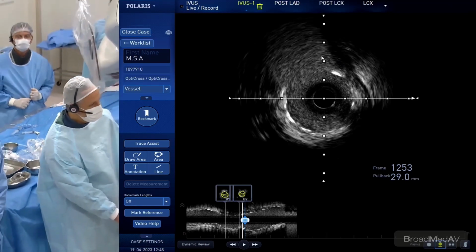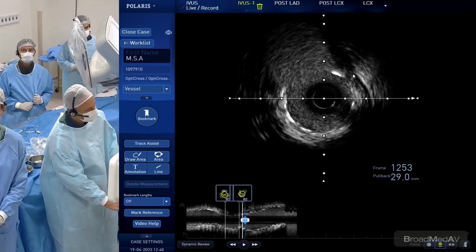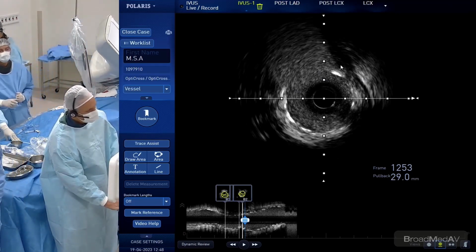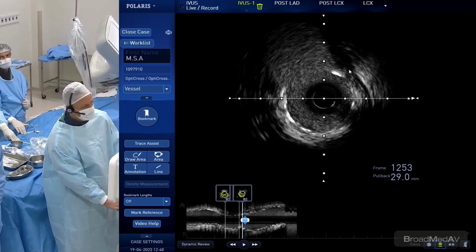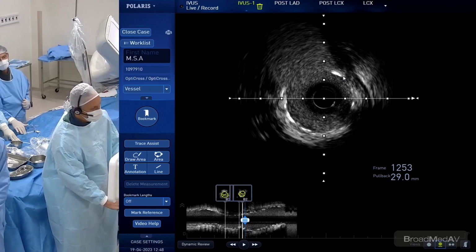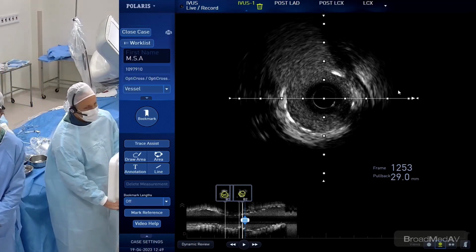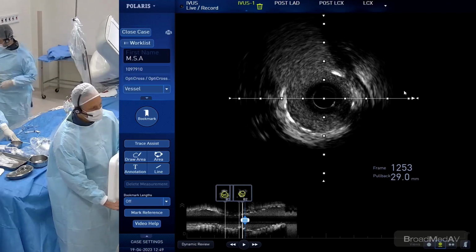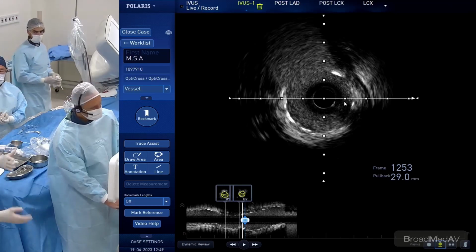Great. So from 10 to 12, you see this very open ostium of the circumflex. There's no significant disease. There's actually no disease there. And we just came back to the early stage, to the original state. This is what we want when you do a provisional. And this is fully open. This is full access. If in the next years, next decade, this patient evolves with disease in the circumflex, you have absolutely no difficulty advancing balloons, stents, and doing procedures.